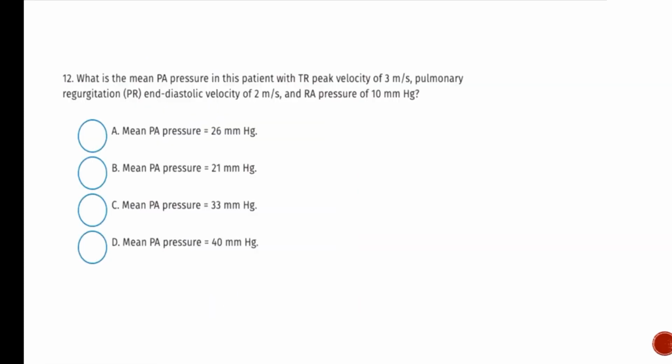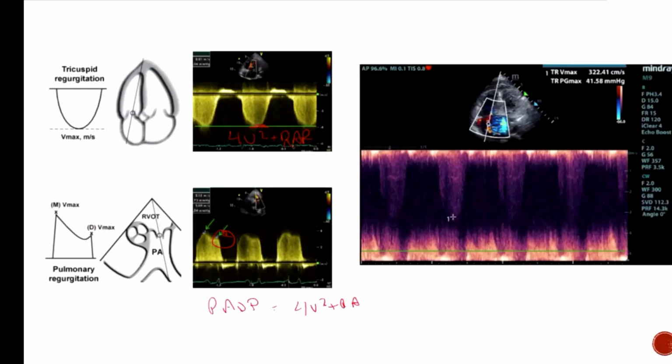I'm going to blow your mind with one more thing that's not on this for some reason. So if we look at a pulmonary acceleration time, basically we're looking at this area here. It's not really set up for that. Pulmonary acceleration time here, that we spoke about before. And our time here to our peak, that's our PAT.